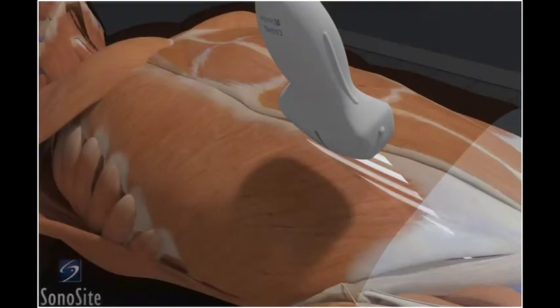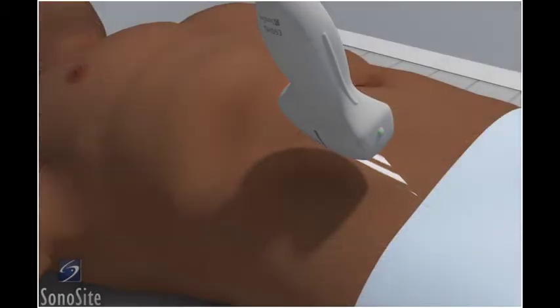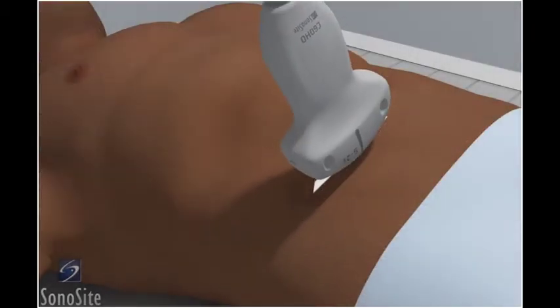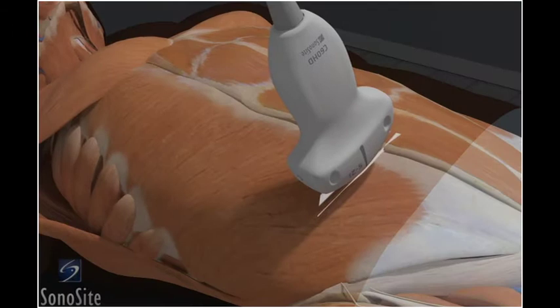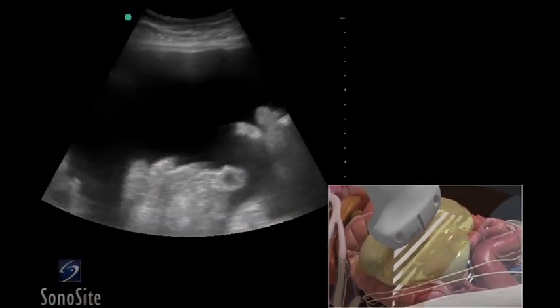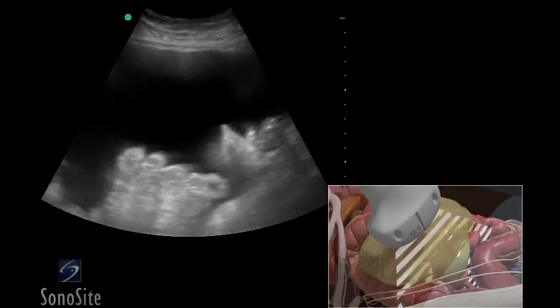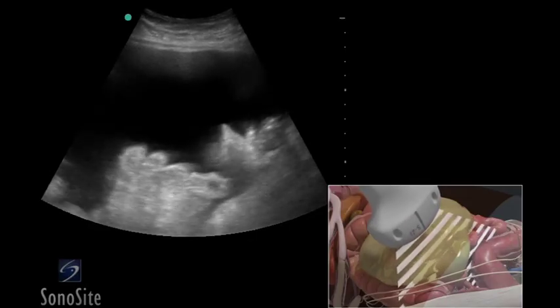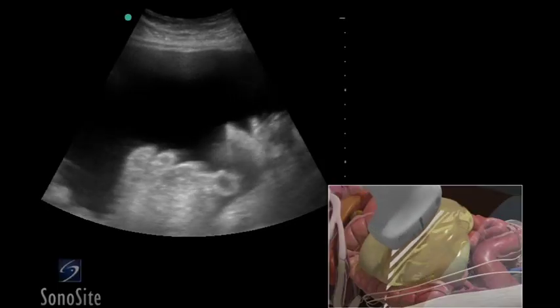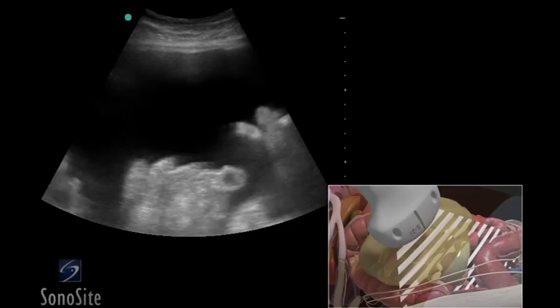The abdominal cavity is evaluated in two planes. Place the transducer in a transverse position with the orientation marker to the right. The transducer is placed at the lateral border of the rectus sheath at the level of the umbilicus. To evaluate the abdominal cavity for free fluid, sweep the transducer from an inferior to superior position. Fluid will appear hypoechoic or anechoic and accumulate in the lateral gutter and between loops of bowel.